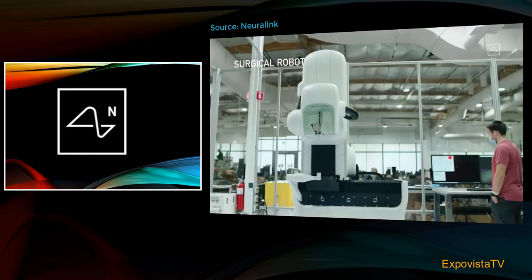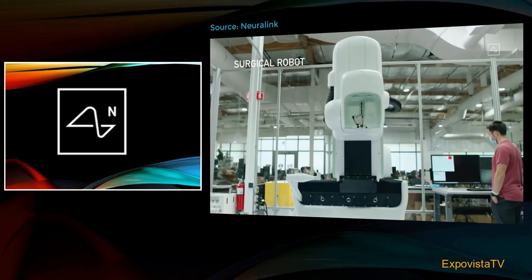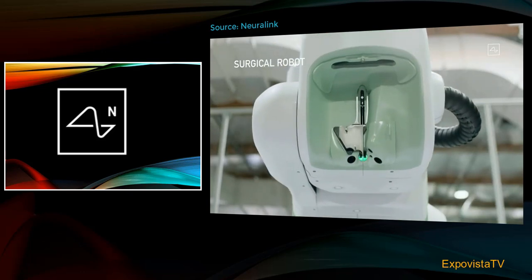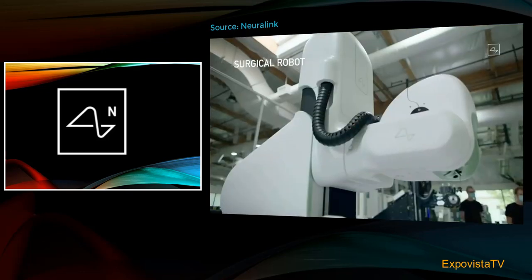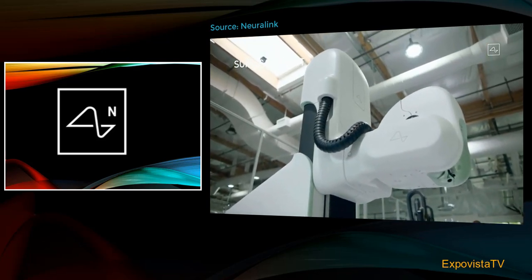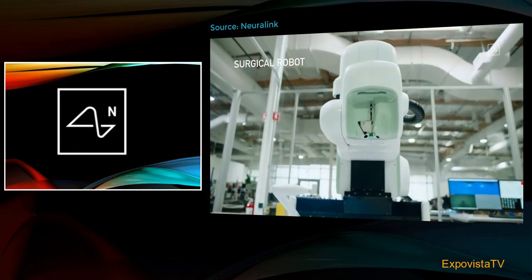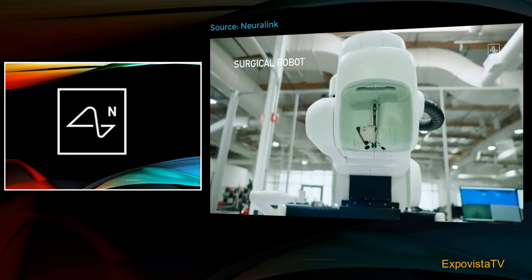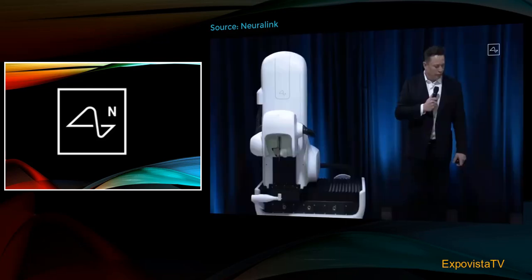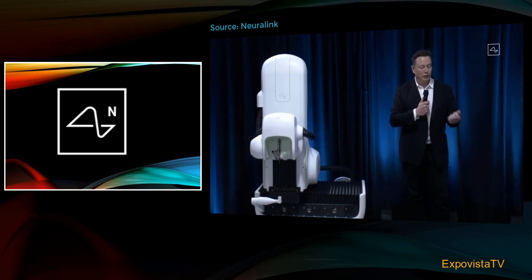This is our surgical robot. We ultimately want this robot to do essentially the entire surgery — everything from incision, removing the skull, inserting the electrodes, placing the device, and then closing things up and having you ready to leave. So we want to have a fully automated system. To be clear, this robot does actually work — we've used it for all of the implantations.